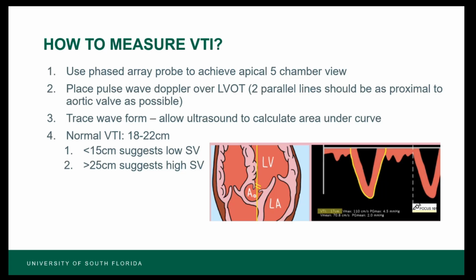And then you can create a waveform, and you see that waveform there on the right.